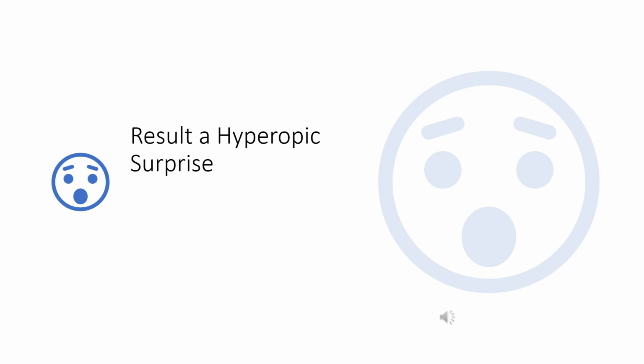And if it gives us a steeper corneal result, then we will be selecting an IOL power which would be less to counter the steepness, and therefore we may end up with a hyperopic surprise for these patients.